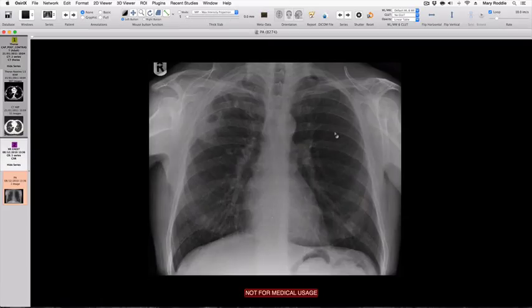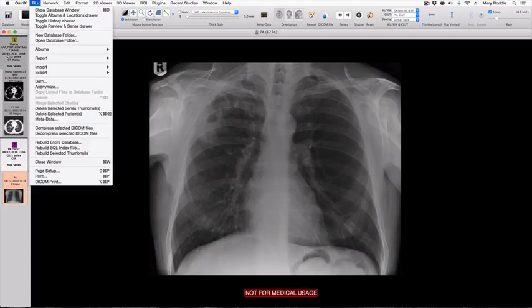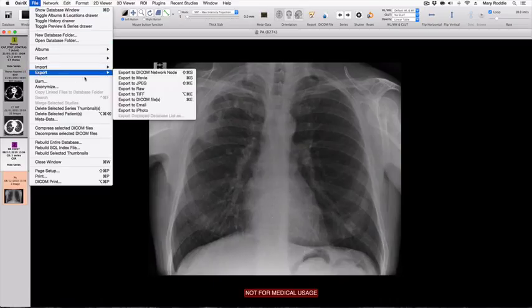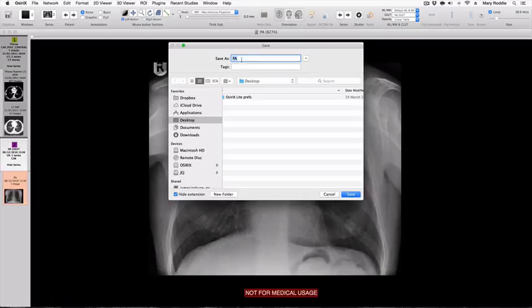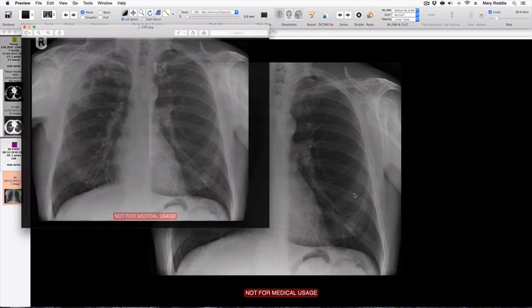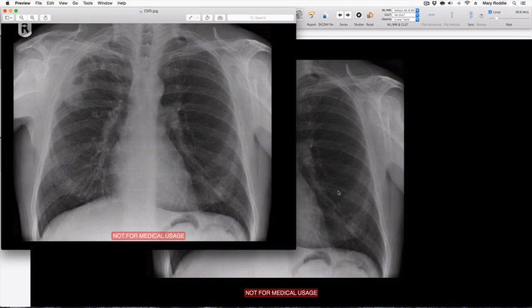If I want to export this chest radiograph as a JPEG to include in a PowerPoint presentation or to add to a document, I go to File under the OSIRx menu, then Export, and choose Export to JPEG, Current Image Only, OK, and then choose where I'd like to save it. I'll save it to the desktop and press Save. You can see that even though the 'Not For Medical Usage' logo was not overlying the image when we exported it, it has been burned onto the exported JPEG.